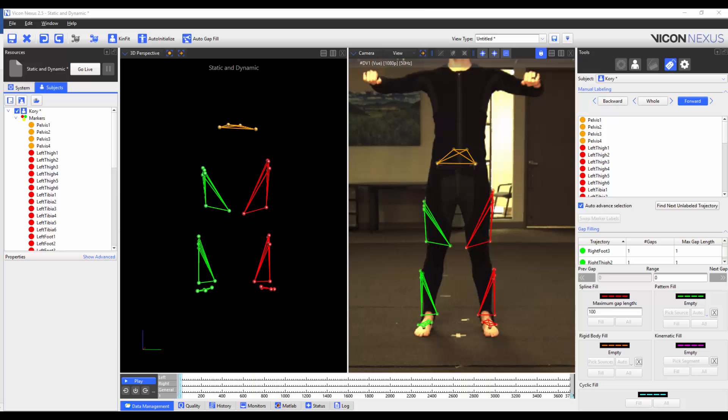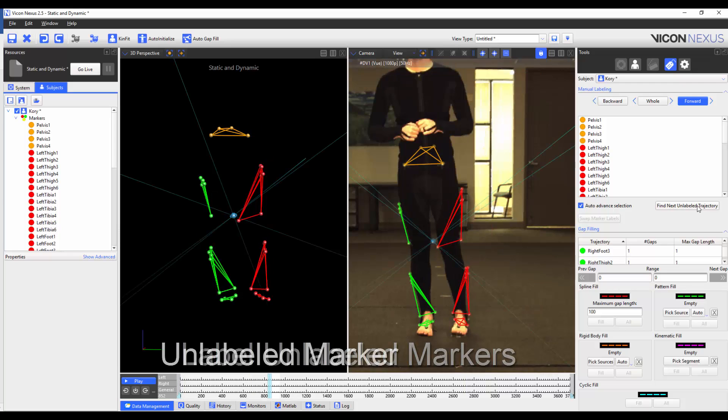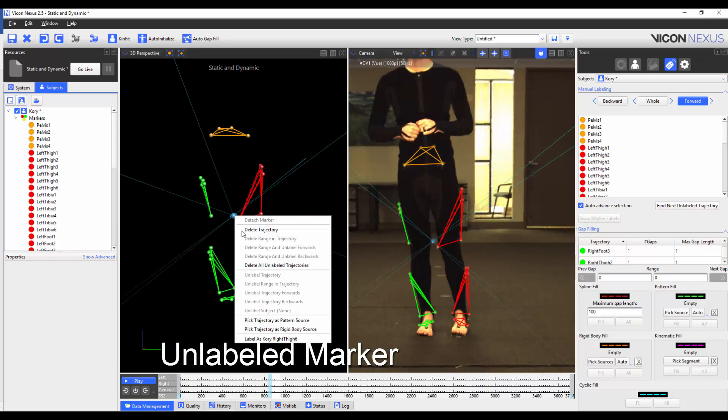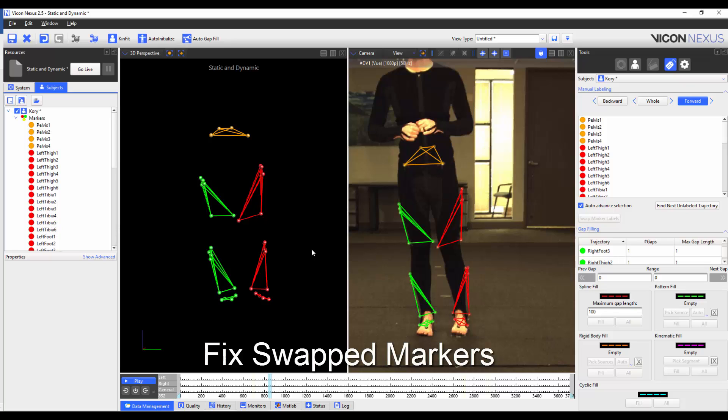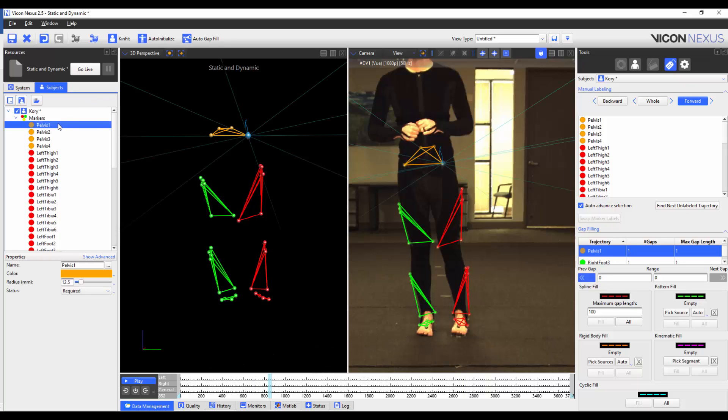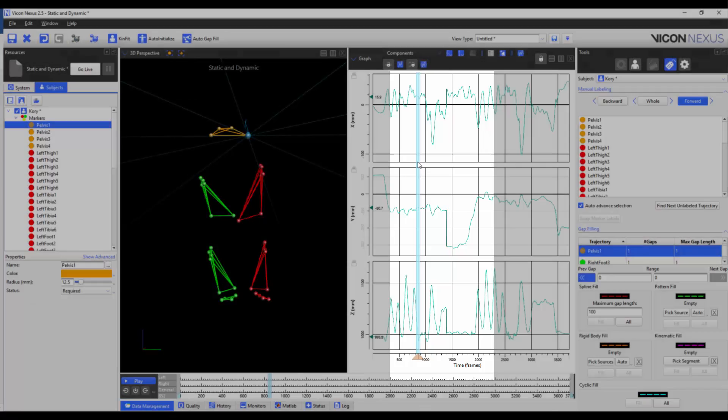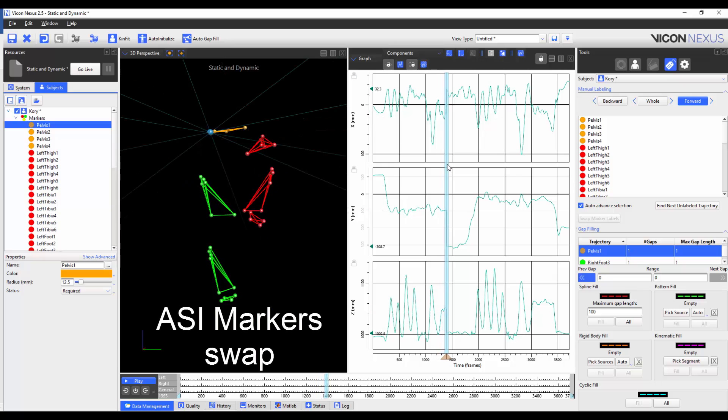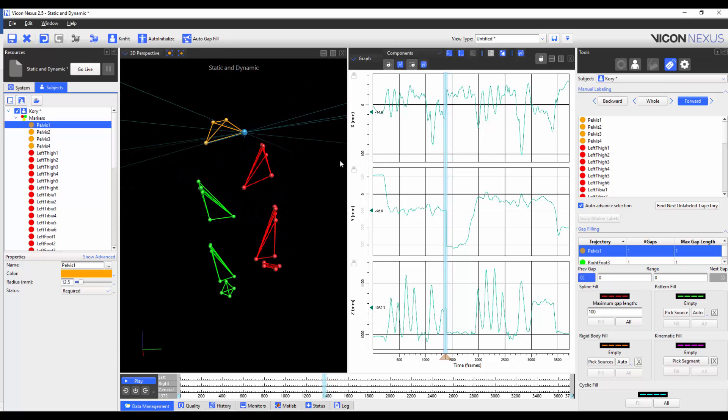I'm now going to go through the trial and make sure that my markers are correctly labelled. This means that if markers become unlabelled, I label them properly. If markers switch, I switch them back. To illustrate the point, I know that my two ASI markers switch. I can check this in the graph view where I can see that there is a large jump in the y-axis which is not accurate. So I'm going to make sure that I fix the labelling for the remainder of the trial.